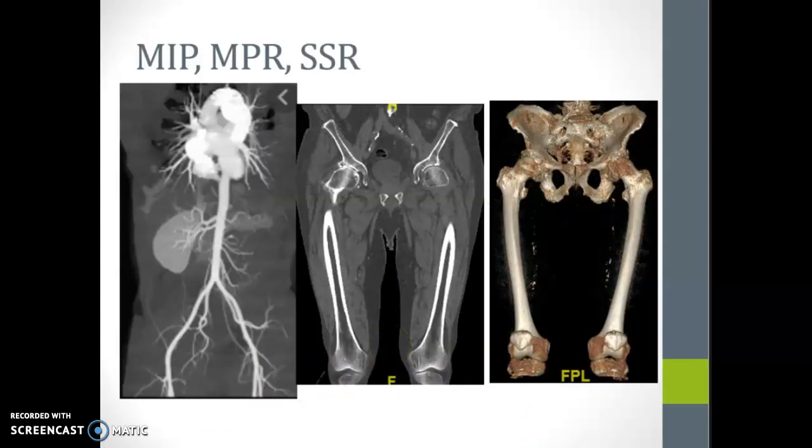This shows the 3 different types of CT scan, and you can see here that you can reconstruct the pelvis and the bony anatomy really quite nicely in 3D. So this is really useful in trauma imaging to be able to recreate a 3D image.